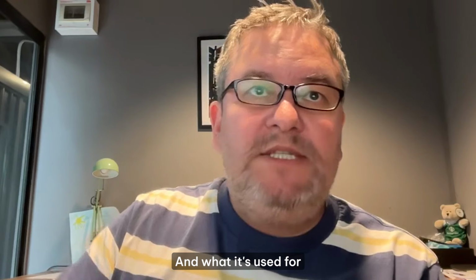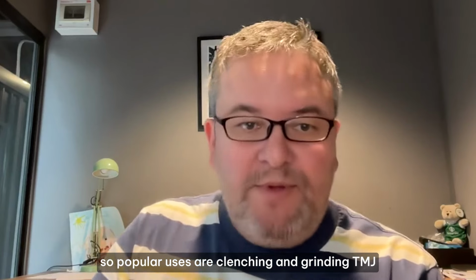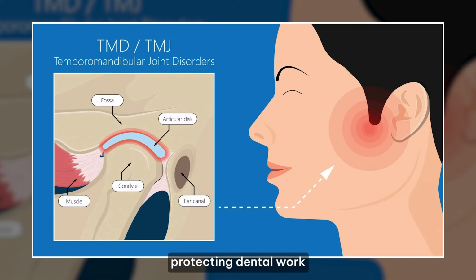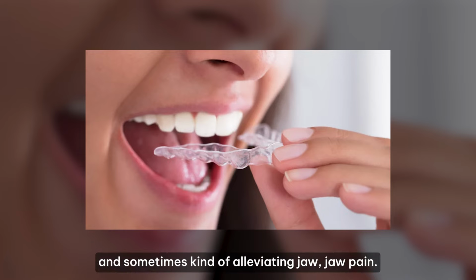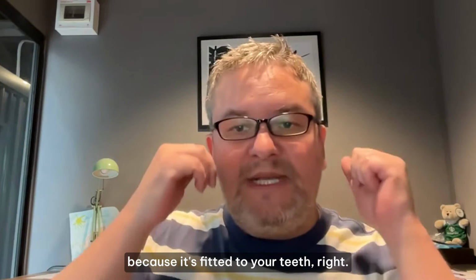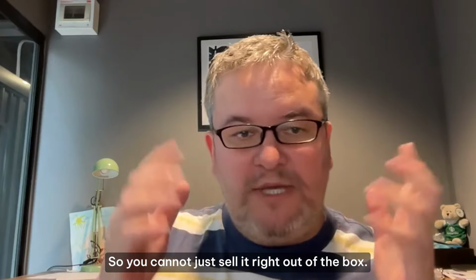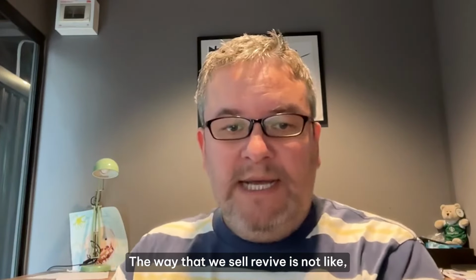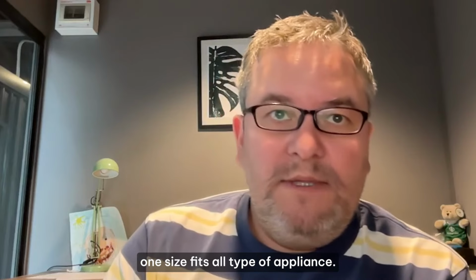And what it's used for, so popular uses are clenching and grinding, TMJ, protecting dental work, and sometimes alleviating jaw pain. Why is it custom? It's custom because it's fitted to your teeth, right? So you cannot just sell it right out of the box the way that we sell Reviv. It's not like a one size fits all type appliance.